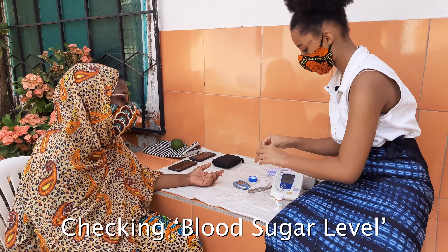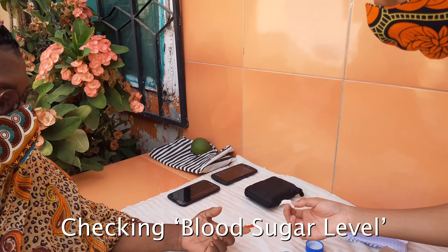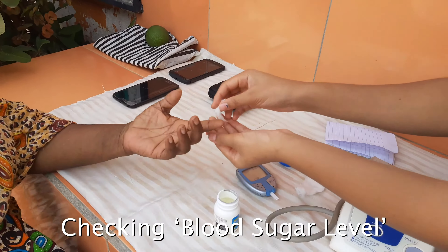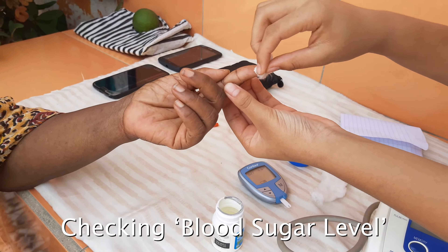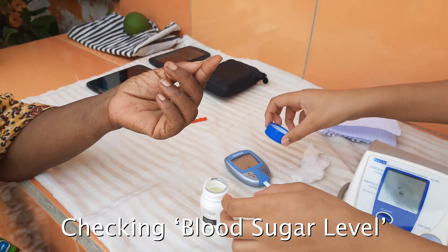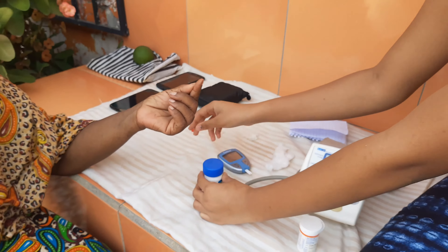Now we're going to be doing the blood sugar. So you have put the contour strips into the contour. And then now what are you doing? We're going to clean the finger. And then place it. Make sure to close it. And my hands have been washed — don't worry.